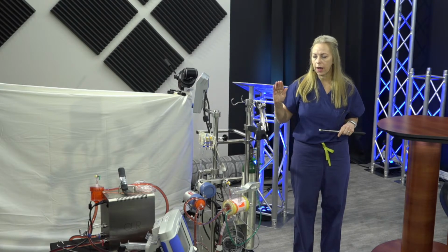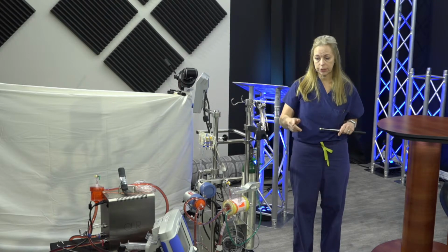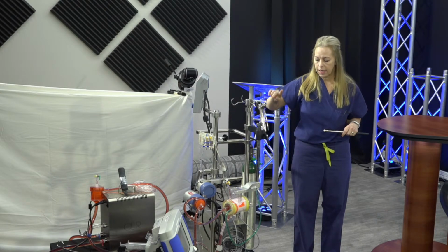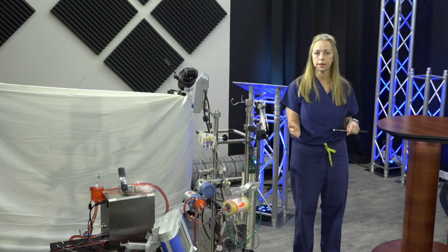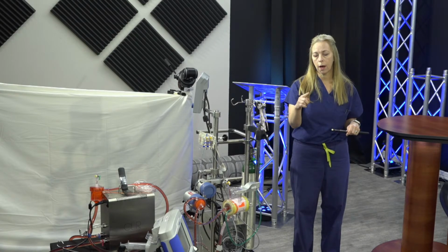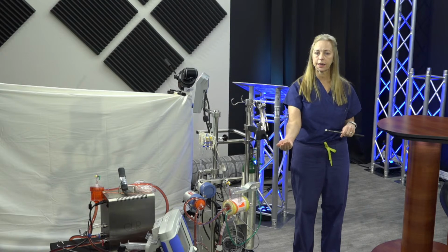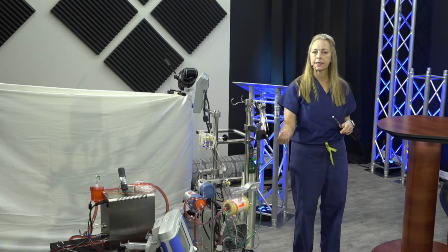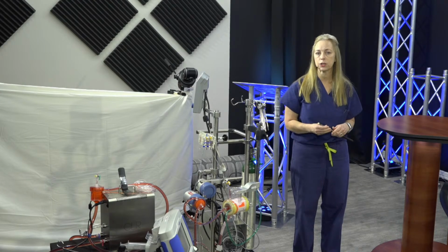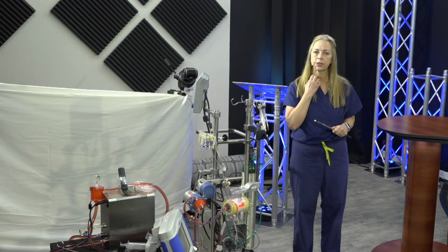Then you tell it that you're giving the bolus. It pushes it through the circuit just by the normal flow of the circuit, goes up into the patient, and then depending on how much it sees the saline, because of course that's different than blood, it can tell when it comes back how much returns back. That's how you get your recirculation.